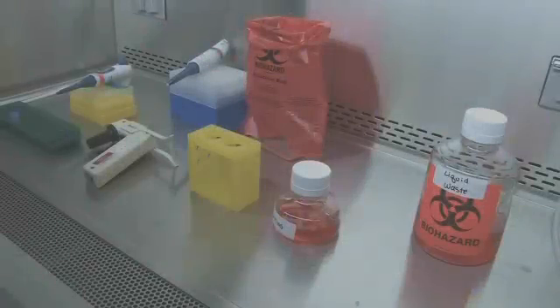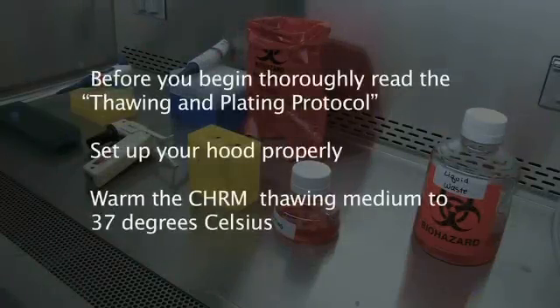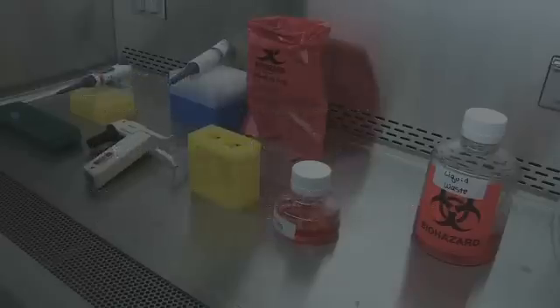Before you begin, ensure you have read the thawing and plating protocol thoroughly and set up your hood properly. Also, ensure the CHRM thawing medium is warmed to 37 degrees Celsius. Once you are ready, transfer your vial of cryopreserved hepatocytes to the lab.